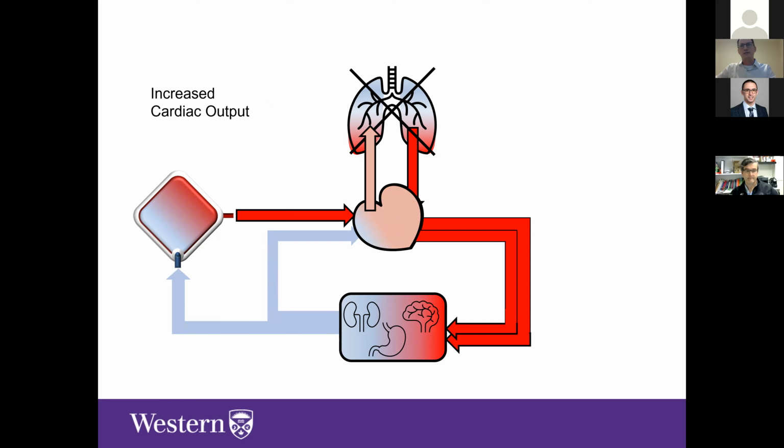And then you're going to get deoxygenated blood that goes to the lungs, back to the left side, and to the rest of the body. So what I've highlighted is when the lungs aren't doing anything, oxygenation is dependent on flow through the ECMO circuit. So if you decrease flow through the ECMO circuit or you increase native cardiac output, you will see hypoxemia. So sepsis may create hypoxemia, or changing flow because you've changed preload and afterload.